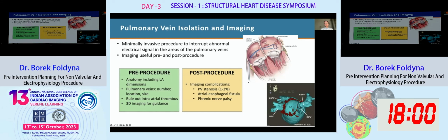Here you can see the procedure. The EP lab goes through the inferior vena cava, transseptal approach, and then towards the individual ostia with the ablation. And here you can see the corresponding image.